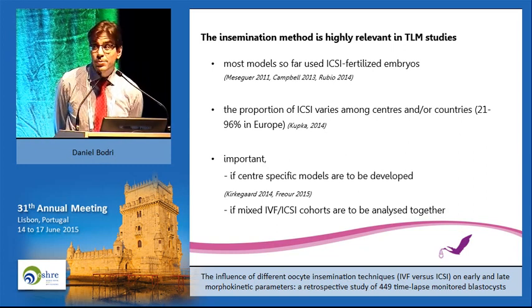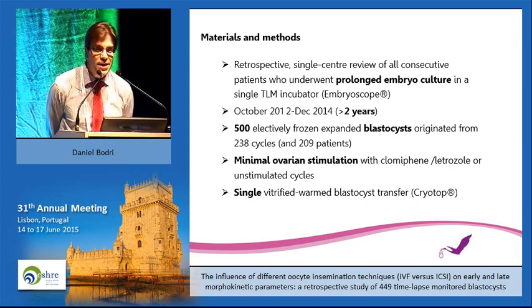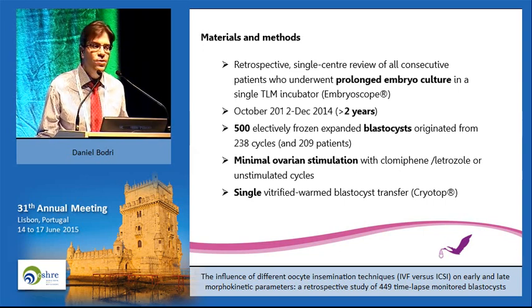In fact, this was the main motivation of our study, because we wanted to determine how to correctly handle a mixed fertilization cohort so that all embryos in the sample could be taken into account. This retrospective review included the embryos of all consecutive patients who have undergone prolonged embryo culture in a single time-lapse incubator since its acquisition at the end of 2012 until December 2014.